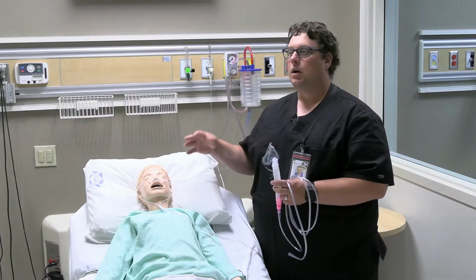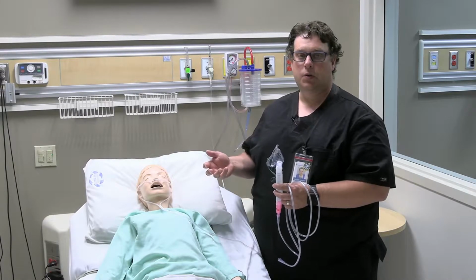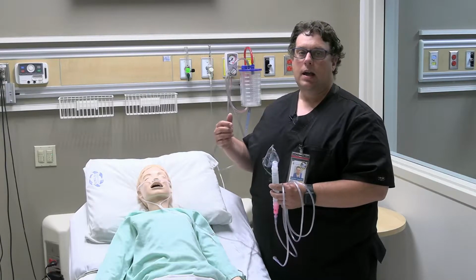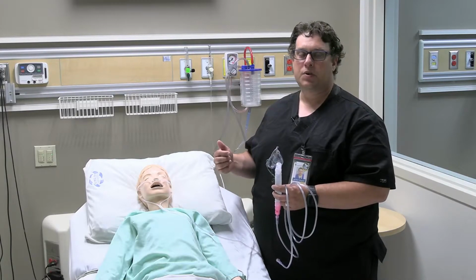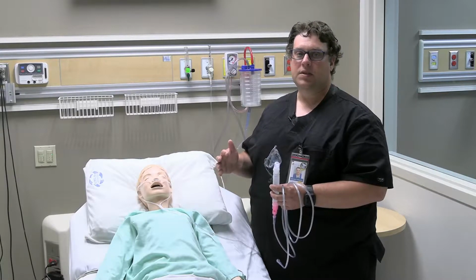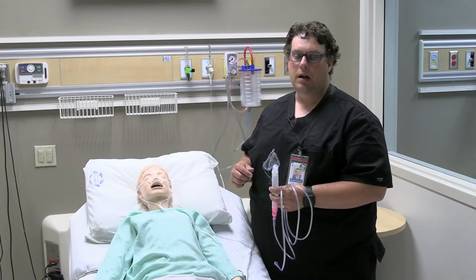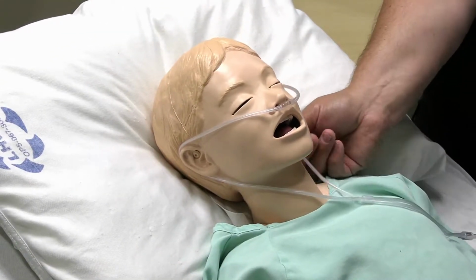But before we do that, we want to talk again about why we're considering moving off of the nasal prongs and onto the Venti-Mask. That is based off our SAT target. Typically, you're going to have a SAT target order to keep SATs greater than or equal to 92%. But if you remember, you should always supplement oxygen therapy when SATs are less than 94%. So again, anytime you're sitting at less than 94, you want to supplement your patient's oxygen therapy. You want to remove the nasal prongs from your patient.